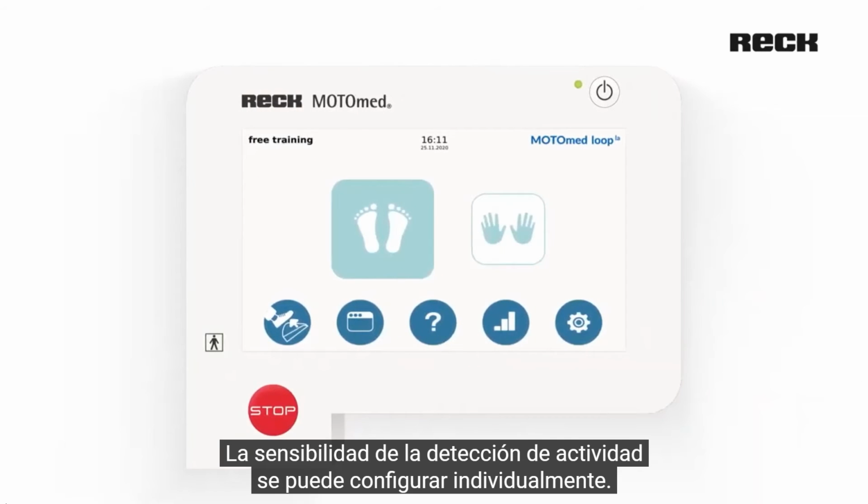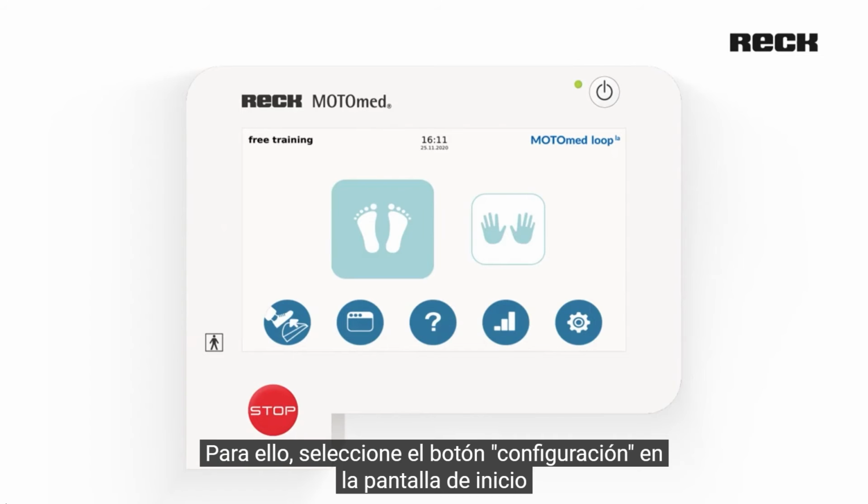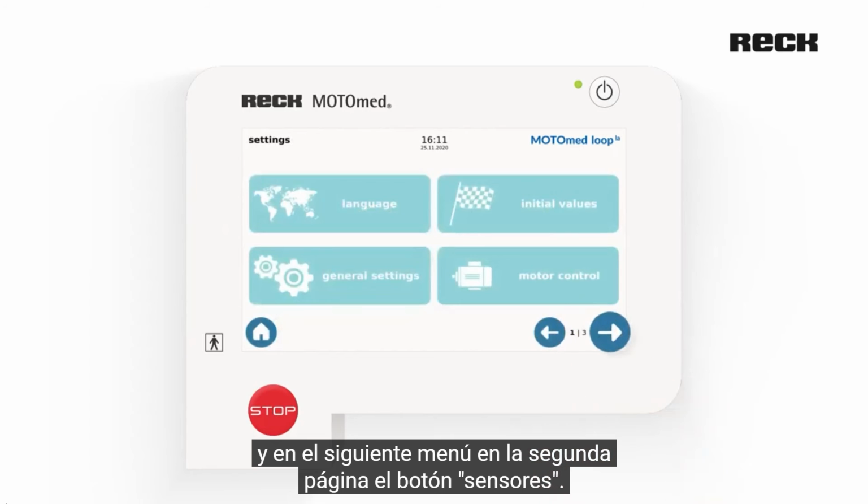The sensitivity of the activity detection can be set individually. To do so, select the Settings button on the home screen, and in the following menu on the second page, the button Sensors.